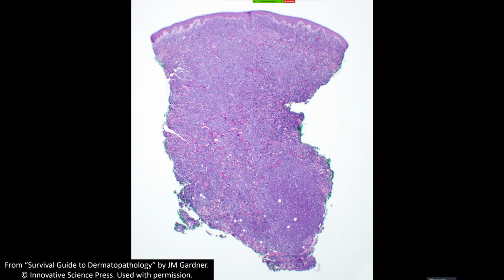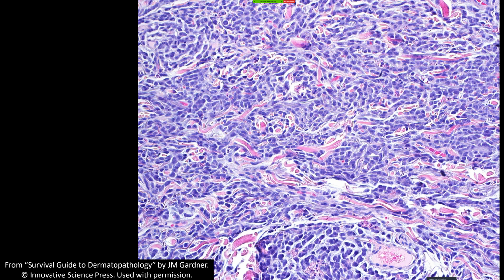So to me, that's very characteristic of hematopoietic malignancies in the skin. Leukemias and lymphomas do that. Particularly leukemia cutis does it, but lymphomas can do that same thing. So when I see that pattern at low power, leukemia cutis is the first thing that comes to my mind. But of course, a wide variety of other round blue cell malignancies could potentially present like this too.